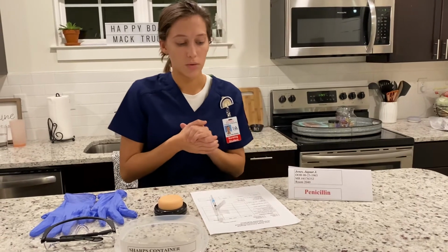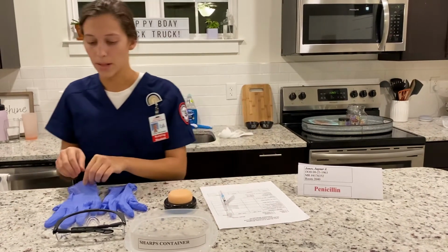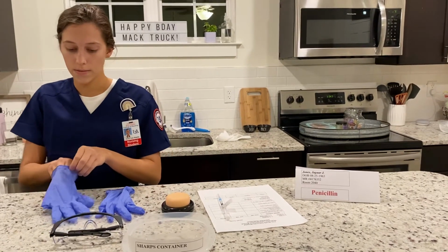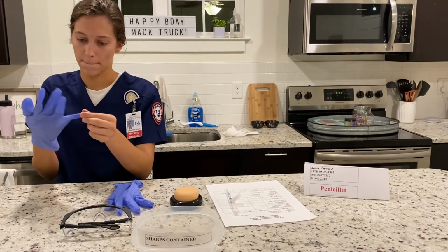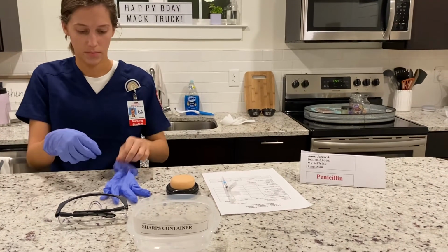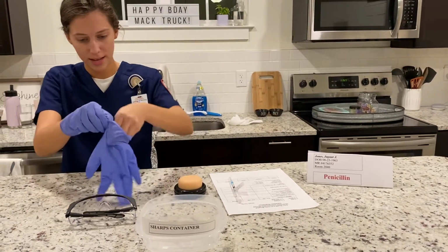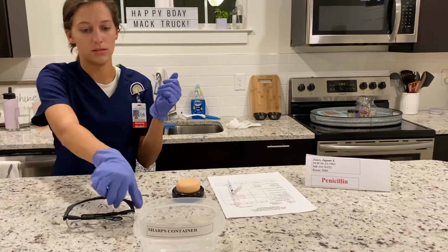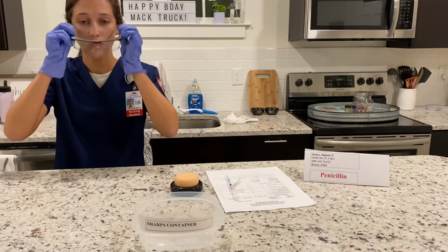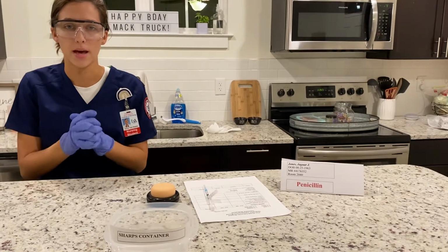And then I'm going to raise the bed, lower the handrails, and then I'm going to apply my gloves. And my other glove. And my goggles. Now I'm going to show the patient where I'm going to be giving this injection.